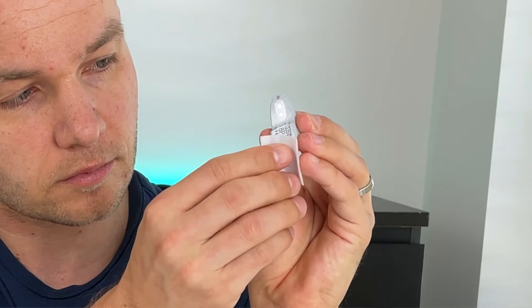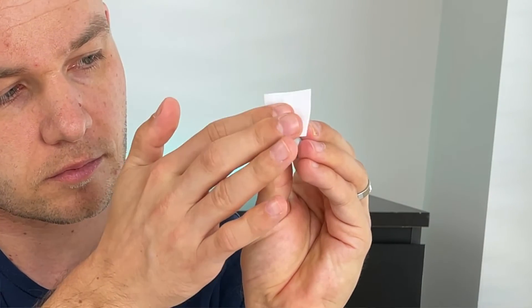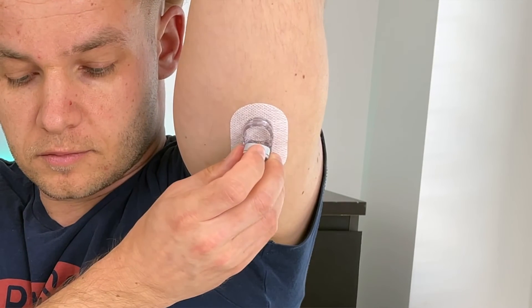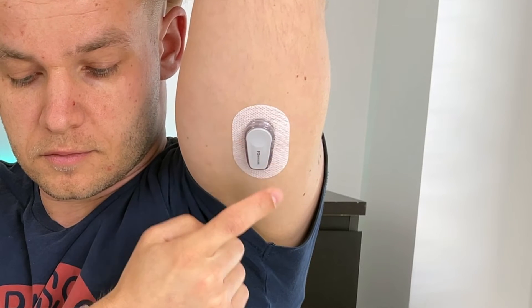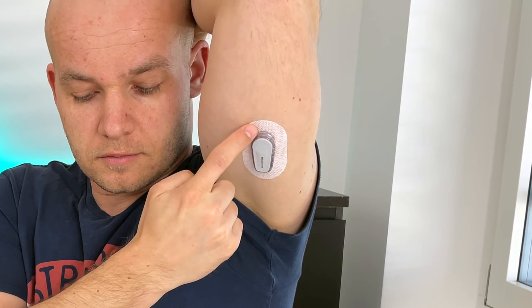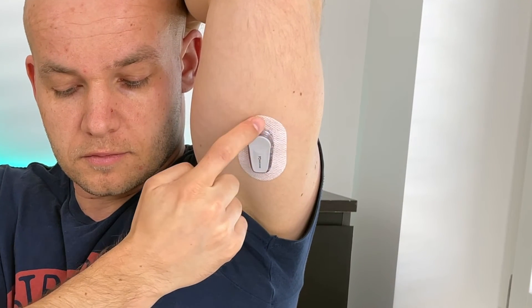By the way, the application doesn't hurt and you can barely feel it. Once you attach the sensor it will be good for 10 days. But we're not done yet — we need to attach the transmitter. Take the transmitter, clean it with an alcohol wipe and let it dry, then insert the toe of the transmitter into the slot of the transmitter holder and snap it firmly into place. The transmitter is good for three months and you can use it repeatedly for a total of nine sensors. You should also wrap around the patch a couple of times to make sure it's firmly stuck to your skin.